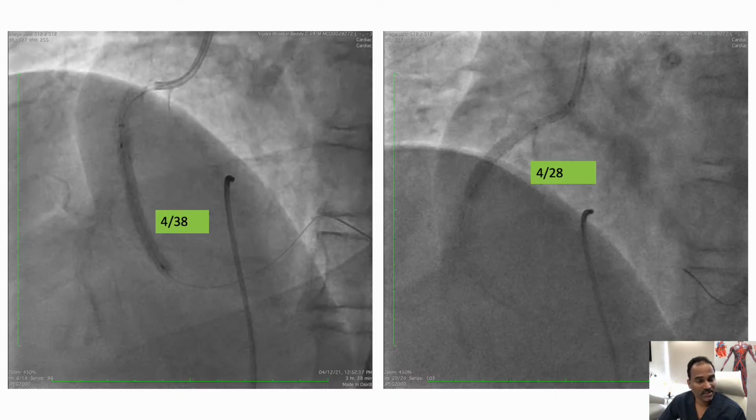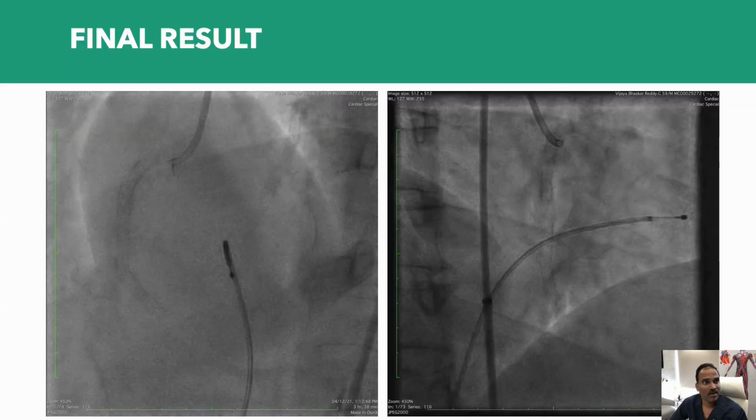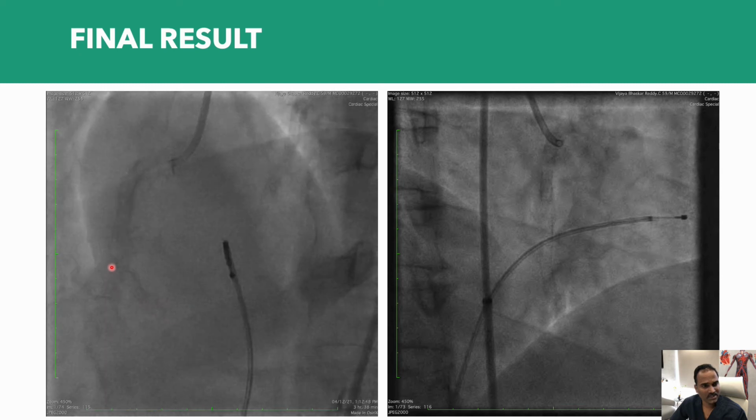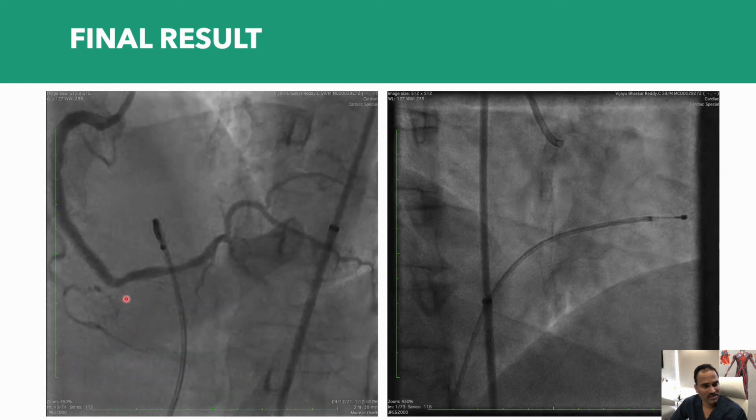Then we stented the whole vessel covering the distal lesion here with the 438 and 428 stents. Essentially I had to put in another stent here because I did a rotablation and we did extrastent plaque modification. We have disturbed struts here and caused a strut fracture, which we have visualized in IVUS. That's the reason we decided to cover even proximal with another stent, 4x28. These sizes are chosen based on IVUS. And you can see this is the final result. We had a good stent expansion and a nice lumen throughout.